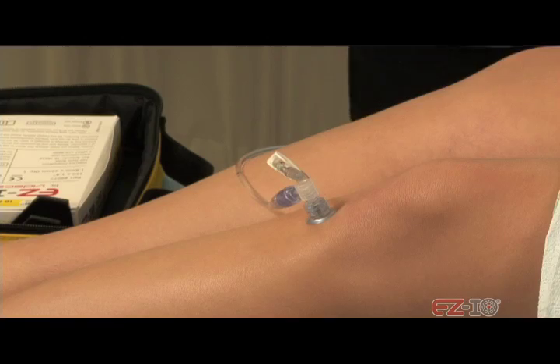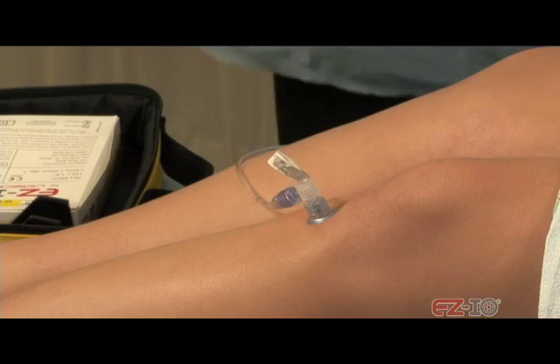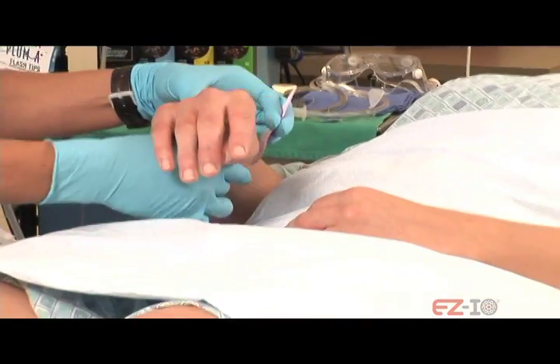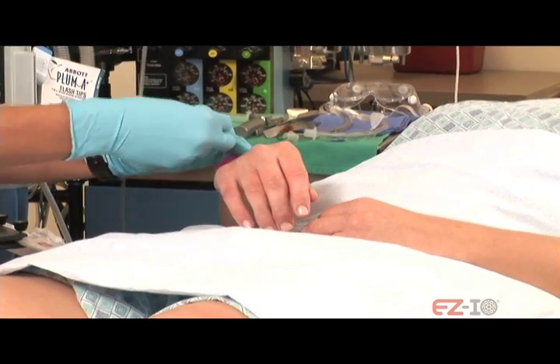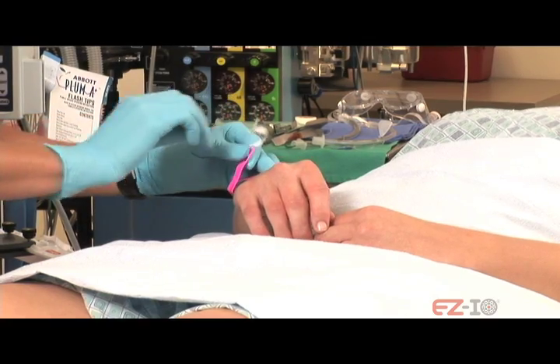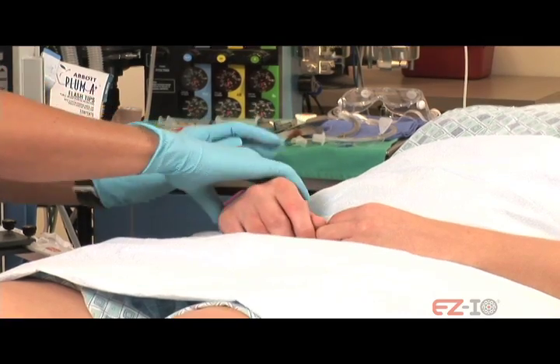All right, I'm just going to check that and make sure I don't have any fluid leaking around it. Great. Now the last thing is just to put the wristband on. This just lets everyone else in the hospital know that you've got an IO in place. All right, there you go. You did great.